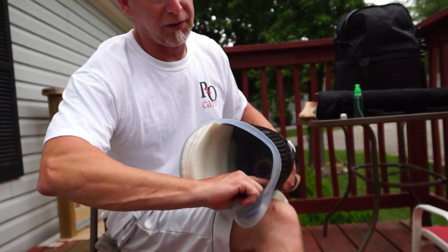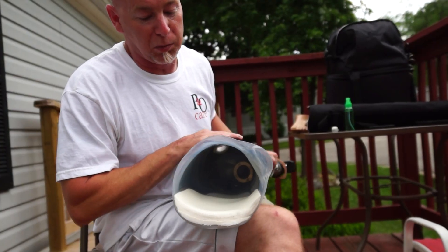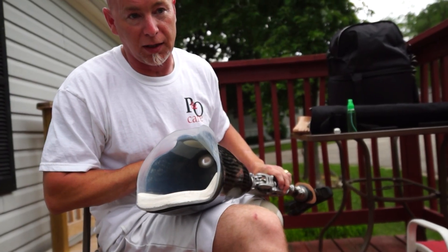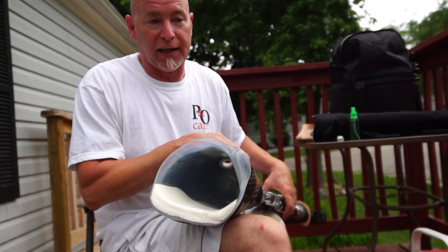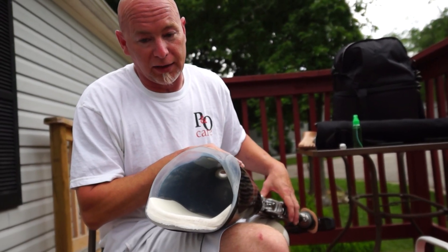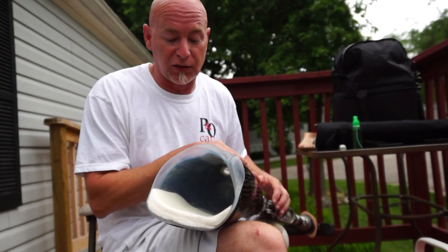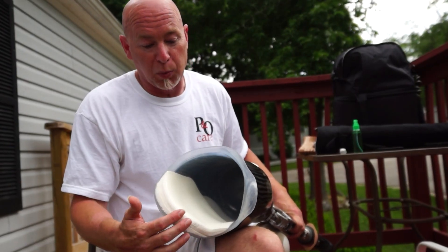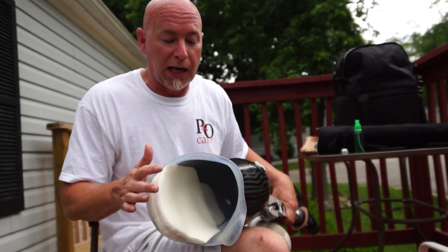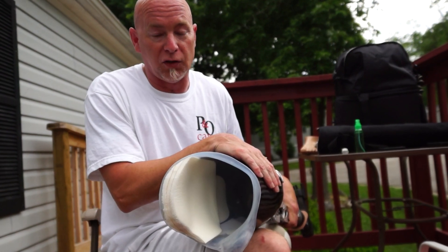I've also got pads on the inside that you can see, which they did probably within the first month. Because I'm pretty active — I like to exercise a lot — the more that you exercise the more you shrink and you shrink faster. This is why they have to put all the pads in. Probably within the next month or so I will be getting casted for a new one because this one is finally too big for me.